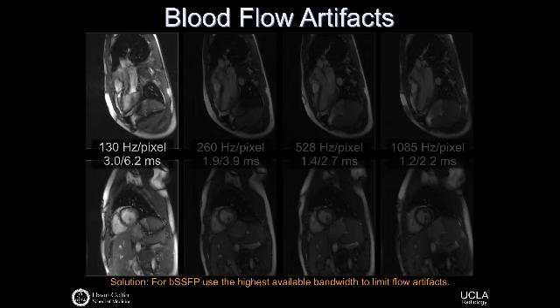These are artifacts. I'm showing a lot of cardiac images, but you would see these for a lot of imaging that would be done anywhere near large vessels especially. So this is blood flow artifacts, and you'll see this sort of spraying of signal. Now, if you're not synchronizing your imaging with the ECG, the artifact may not look quite as distinct, but oftentimes you'll see this spraying of signal away from larger, high flow vessels in particular. So it's good to be able to identify that as a blood flow artifact. It's usually a little bit more focused and distinct than a breathing artifact.